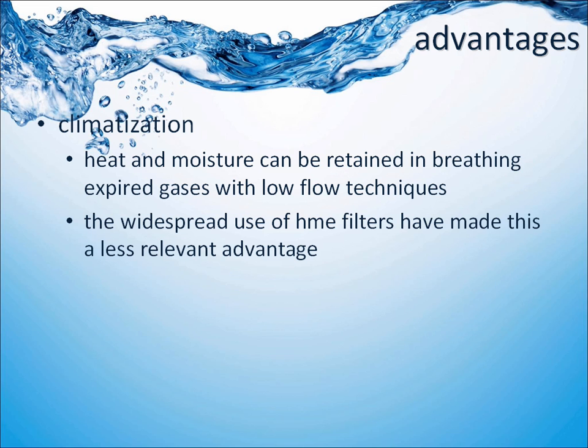This is not so much an advantage anymore, given that we use those HME filters universally now. But as you can imagine, rebreathing allows for the heat and the moisture to be retained every time you rebreathe your last breath. So that's one advantage. If you breathe high flows, you're prone to ciliary dysfunction as well as mucosal damage after a couple of hours.